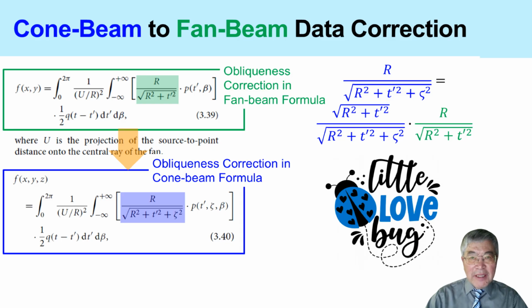This makes the correction point specific and adaptive. It is not just one global correction applied everywhere. It changes depending on the ray direction and the point being reconstructed. That is one reason why the cone beam approximation can produce excellent reconstruction results, even though it is not theoretically exact in the most general case.